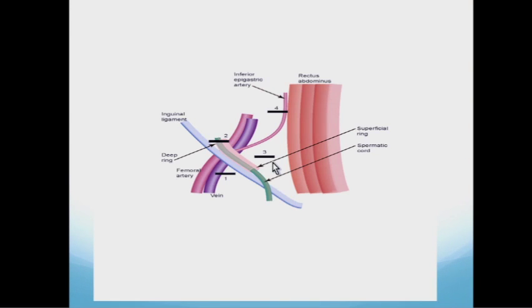Now this diagram shows you the 4 steps that I use to perform a hernia exam. Number 1 is to find the femoral vein and look around the femoral vein as the patient performs a Valsalva and look for a femoral hernia. The femoral hernia projects downward and will project all the way into the medial thigh in a worst case scenario. You should have the patient Valsalva. You should be looking at a point where the saphenous vein comes into the femoral vein.